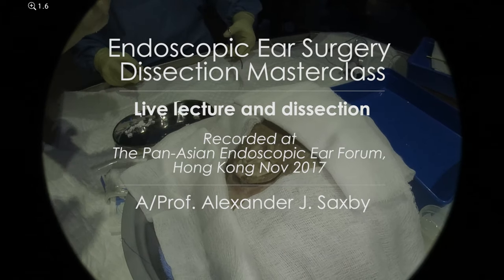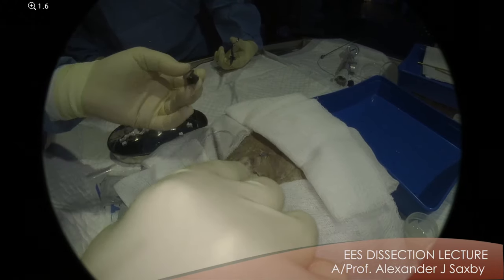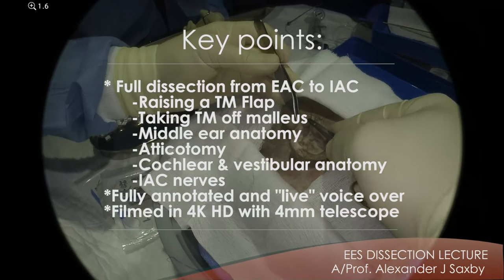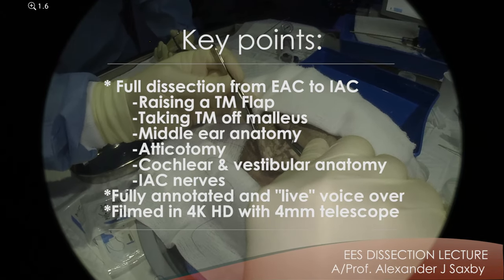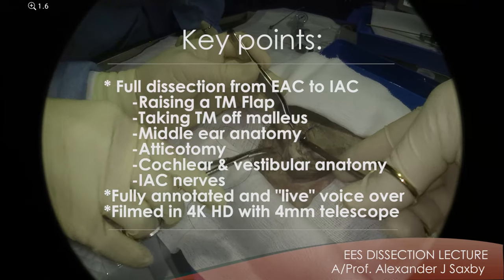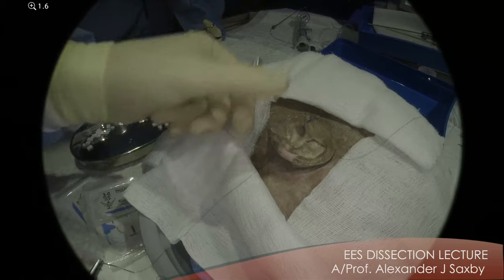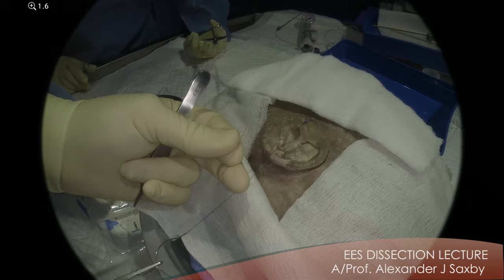And like any surgery, you always have retraction. And because we're not using a speculum, it's important. So posteriorly, it goes under the conchal cartilage and then should come out in the cadaver. It's somewhat tough. There, just in the sulcus. Right in the sulcus there. So you go under the conchal cartilage, and then what it does is it slings around the conchal cartilage and pulls it backwards.